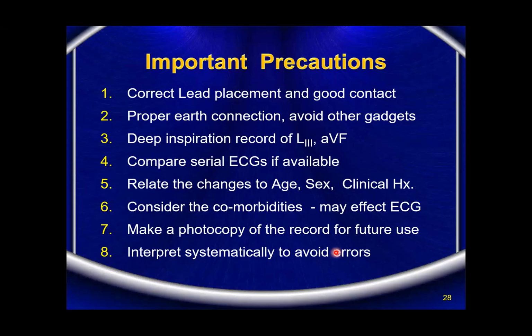So the important precautions are correct lead placement and good contact of the lead, because if I place the lead in one way and another person places the lead in another way, the ECGs cannot be compared.